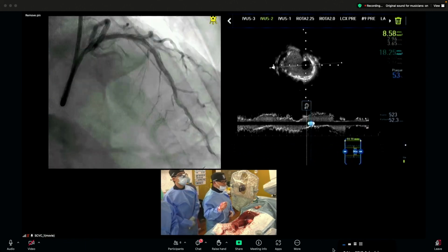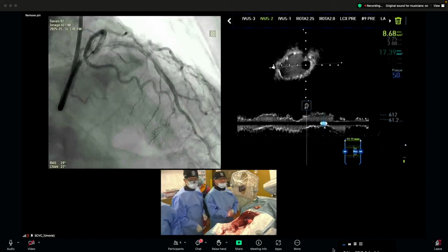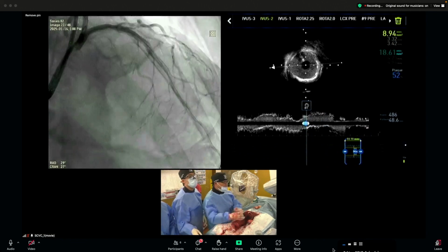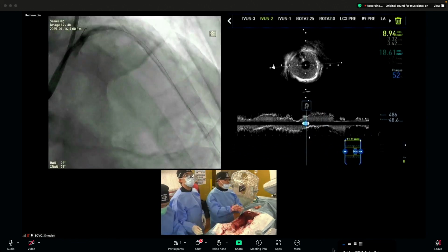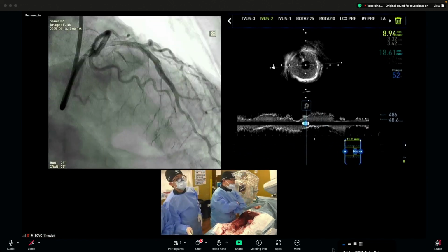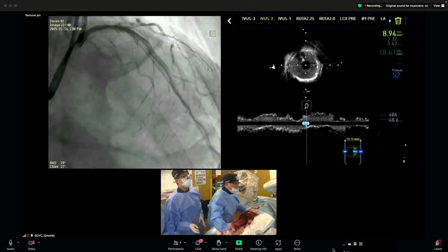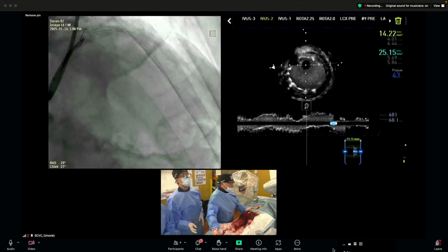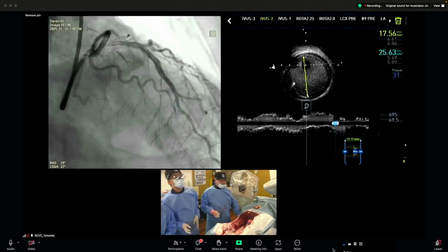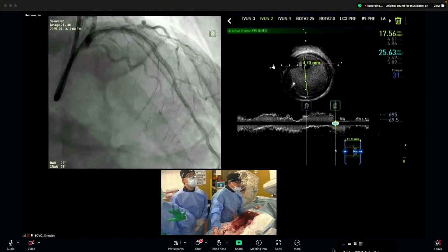Yes. However, looking at the more proximal part, we need more post-dilatation. But anyway, looking at our point of interest, the stent is well expanded, so symmetrically, due to the aggressive Kashima sensei rotablator style. Okay, this is wonderful. The elliptical site in the proximal area, actually, both sides are too small. 2.5, yes, 2.5 is small. But we have to accept the result. But at the bifurcation, it's a perfect stent expansion, circular expansion. I love that. Thank you very much.